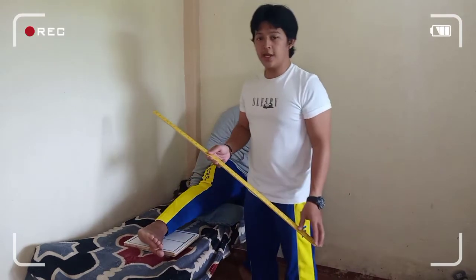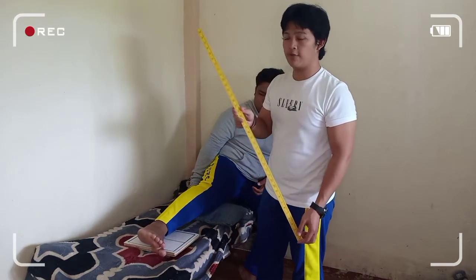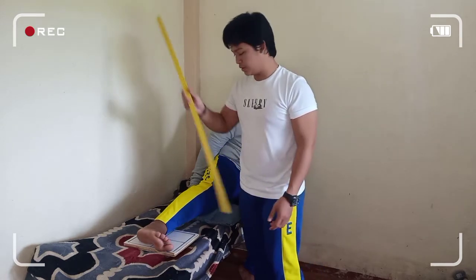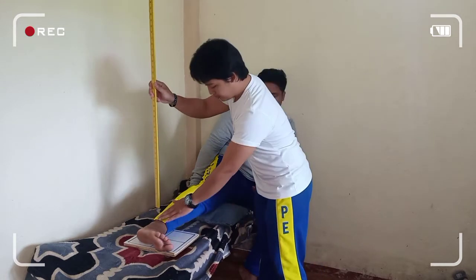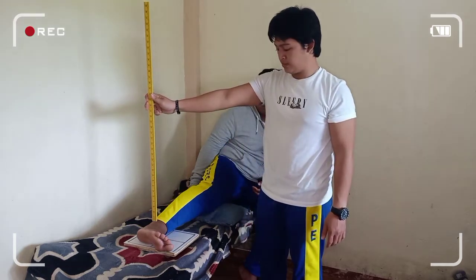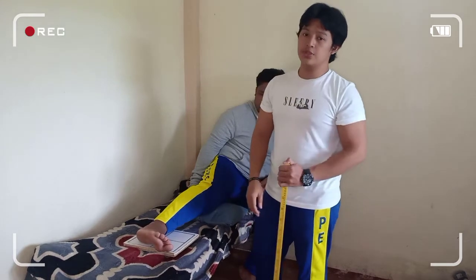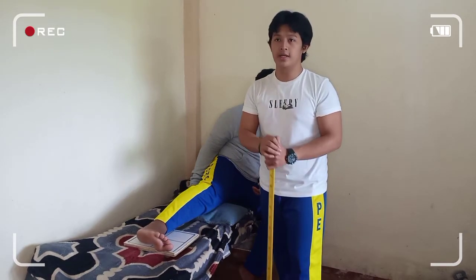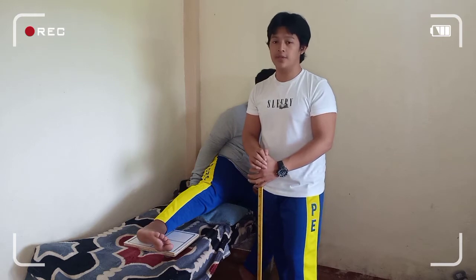And the central ray must be 1/2 inch superior to the lateral malleolus. The structure shown in this projection is the distal end of the tibia and fibula.